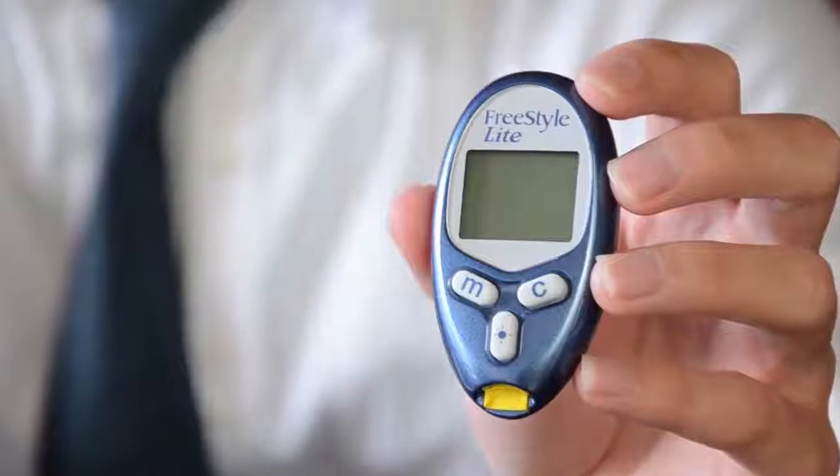I'm Peter Lewin. In today's episode, I'll review Abbott's Freestyle Lite blood glucose meter. The Freestyle Lite is a compact meter and it's actually one of the smallest meters available on the Australian market. It also has several features that many people will find very useful.